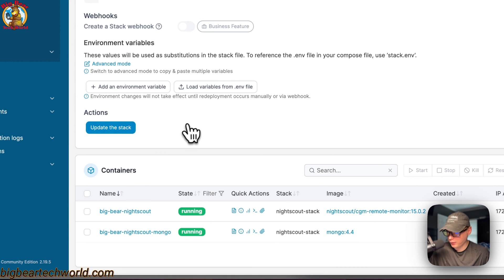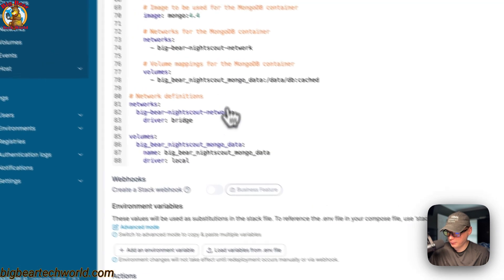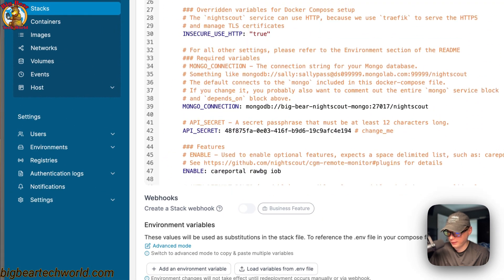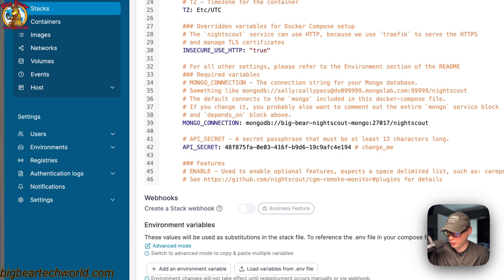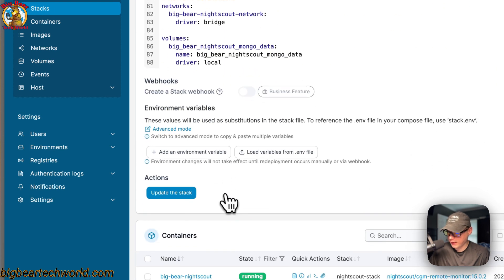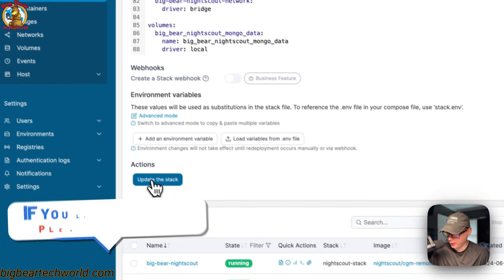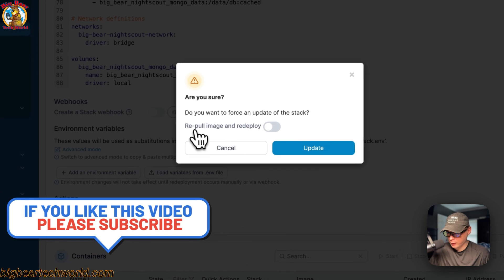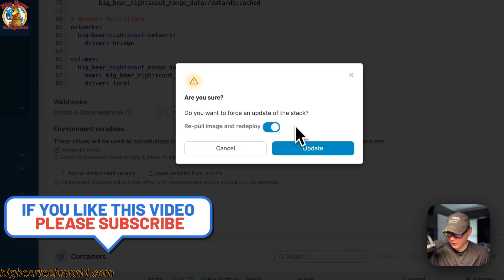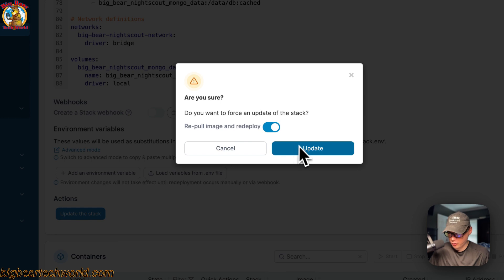If a developer pushed an update to a 'latest' tag or any tag they keep pushing to, you can go to 'Update the Stack', enable 'Re-pull image', and redeploy. This gets the image fresh from the registry and redeploys it. Then just press Update.